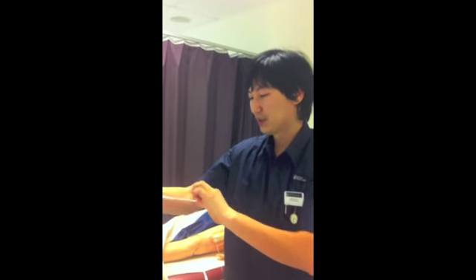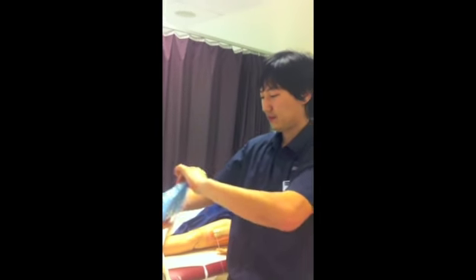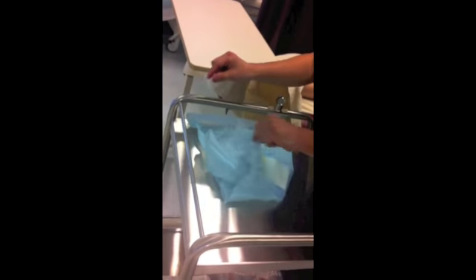Now I'm opening the dressing pack. It is important when opening the dressing pack that we should not touch the inside of the pack.